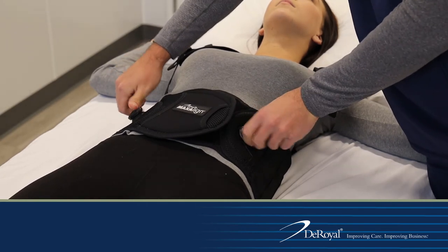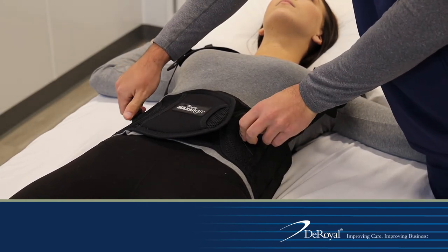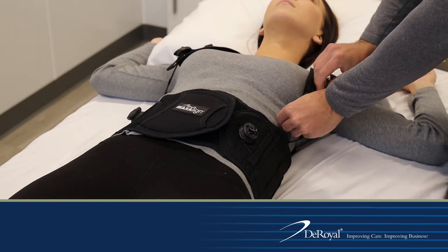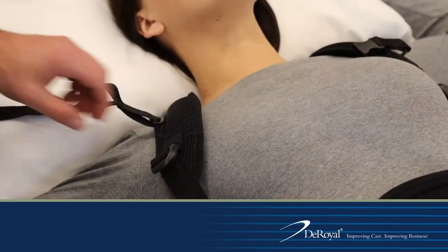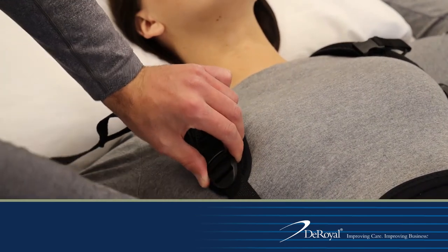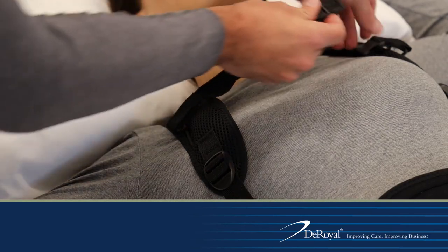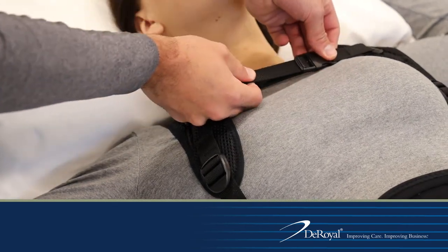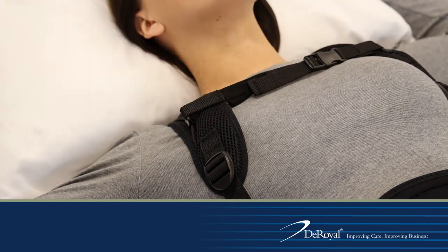Tighten the BOA dials by turning clockwise evenly to provide compression. After the appropriate belt compression is achieved, tighten the DLE using the excess strap under the patient's arm. Position and secure the chest strap and tighten as necessary. If needed, the chest strap can be removed by sliding each side up and off the tubing of the DLE strap.